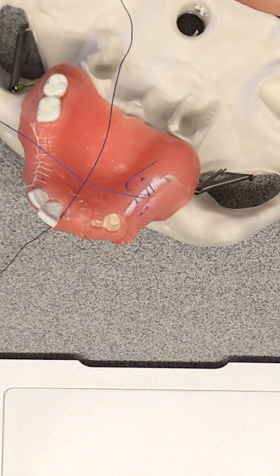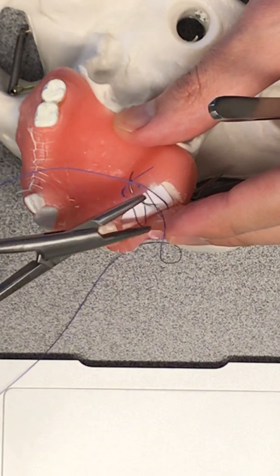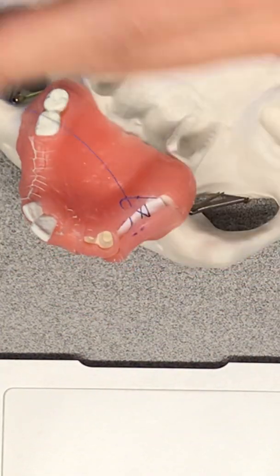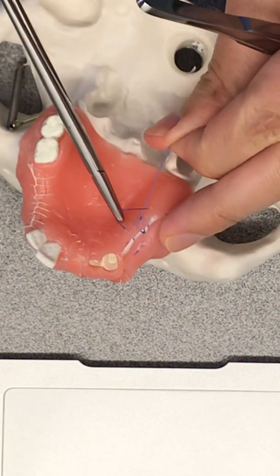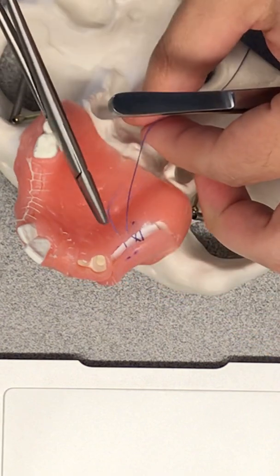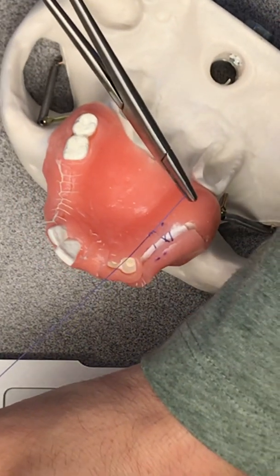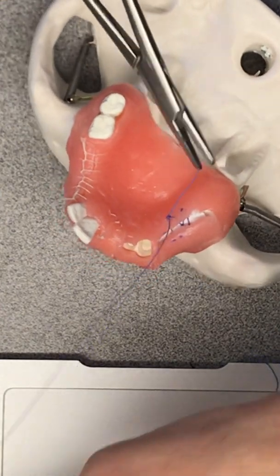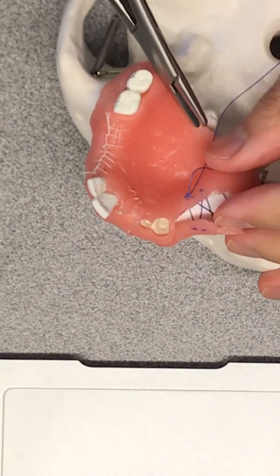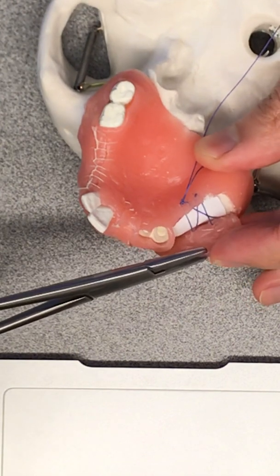Finally, we go back to the palatal flap — connective tissue to epithelium — making sure to tighten both ends of our suture material. This should be the final look of the strapped-in membrane.